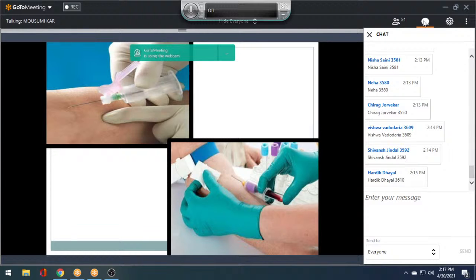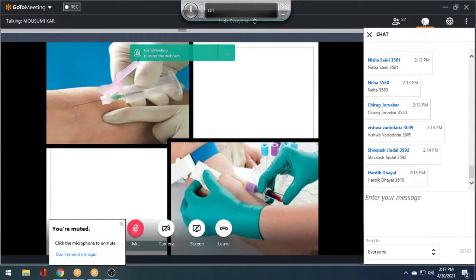So the advantages are, one, you can change tubes with a single prick itself and get multiple samples. Second, the amount of blood that you draw will be precise for the vacuum container that you are collecting. Third, you are not exposing yourself to any of the blood, and disposal is also easier, and you're not opening the container at all. So again, there is no spillage, and you're safer.